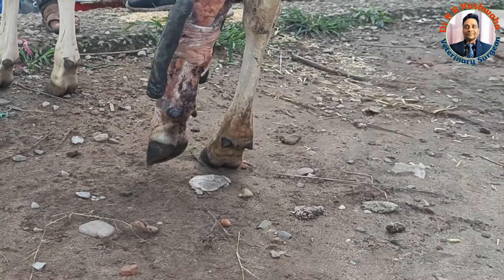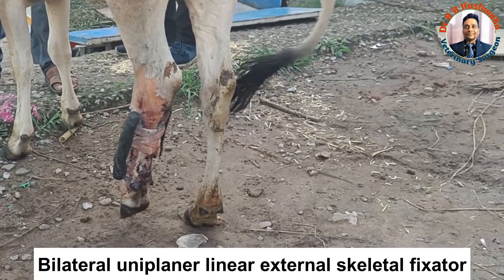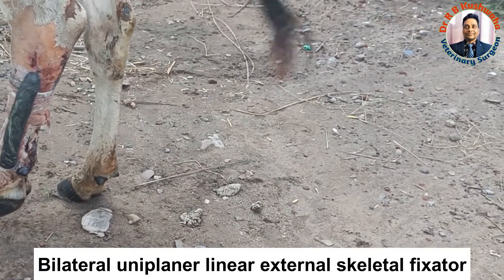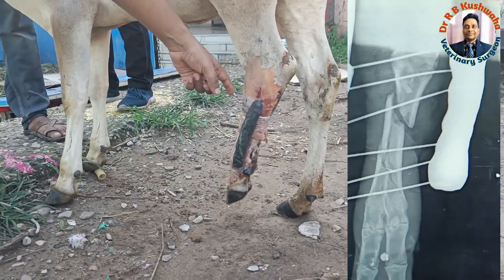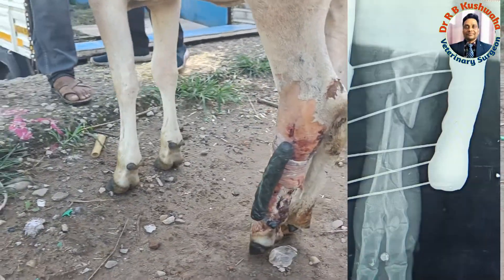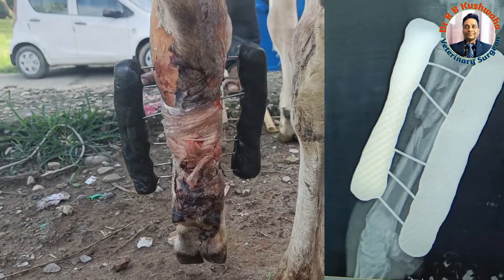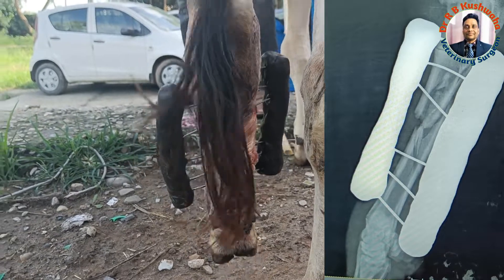This fracture was managed by the bilateral uniplanar linear external skeletal fixator technique. We have placed 2.3 mm K-wire proximally and 3.3 mm K-wire distally.